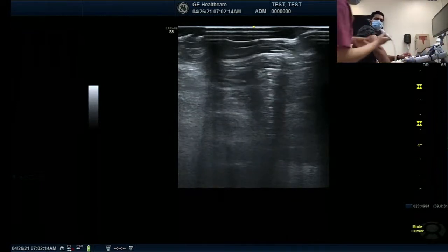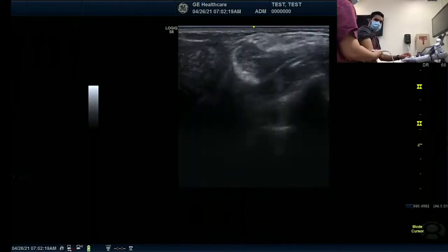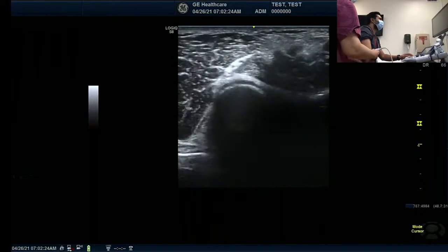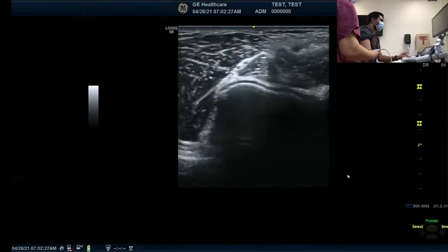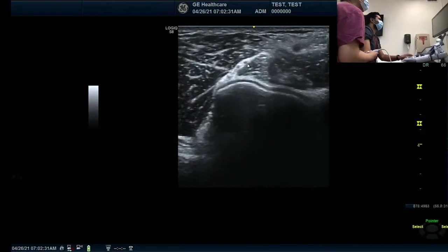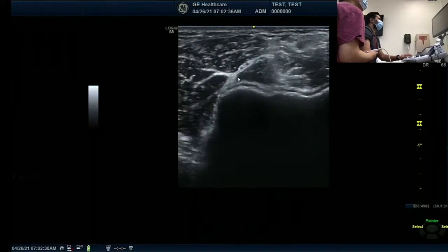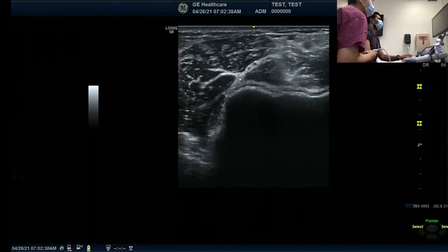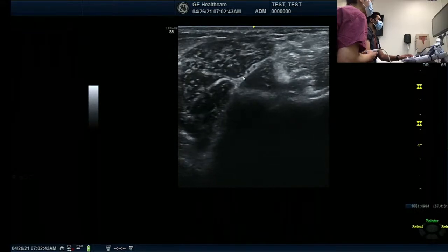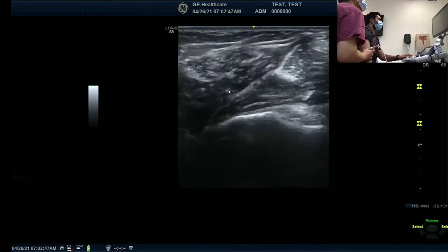If that is hard, we're going to come from the elbow joint, which is our home base. Divas's radial nerve is beautiful, right? There are two nerves you can show. The proximal one is the superficial branch, the lower is the deeper branch. There are a couple of branches here. The radial nerve supplies brachioradialis, extensor carpi radialis longus and brevis before it becomes the deep branch. So I'm going to move proximally.